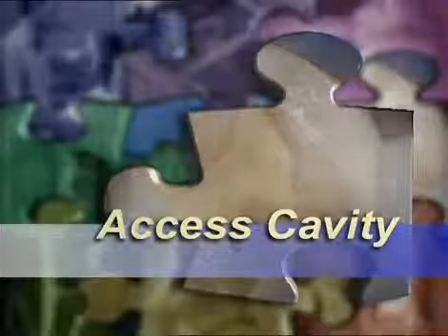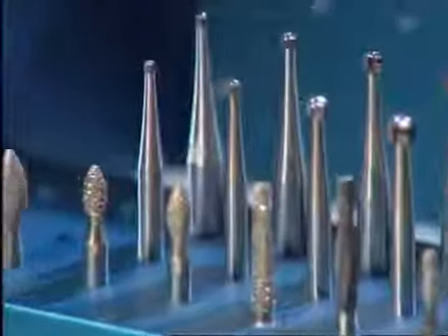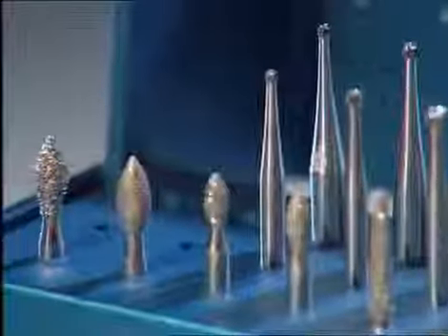The aim of the endodontic access cavity is to create a straight line access to the canal entrance. Old filling material and caries have to be removed. Sometimes it's necessary to build up the tooth first. A specific preparation kit is recommended. Long shank round burrs are used to improve the view for the operator. The initial penetration of the pulpal roof is localized in the center of the central groove, with the burr inclined slightly towards the mesiobuccal cusp.